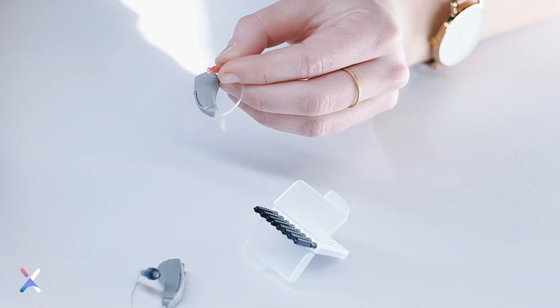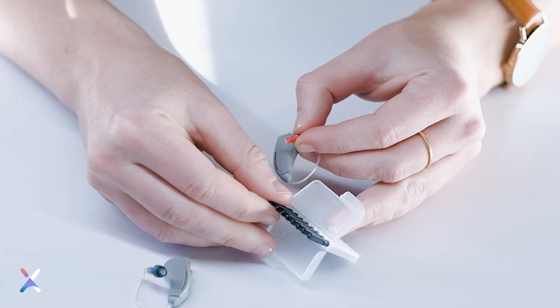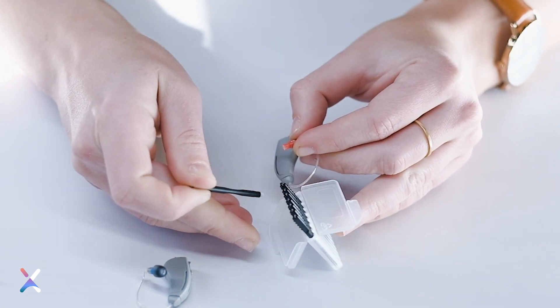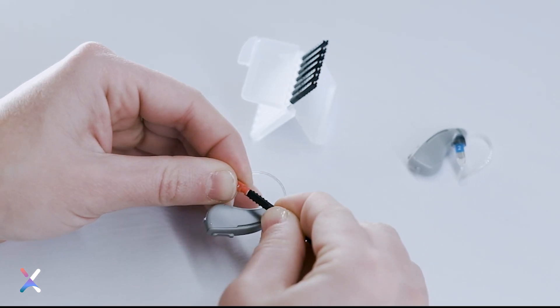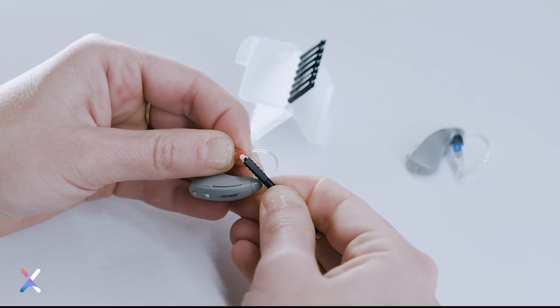Insert the smaller ridged end of the wax guard tool into the center of the white wax guard. Angle the tip of the wax guard tool so it presses against the inside of the wax guard.